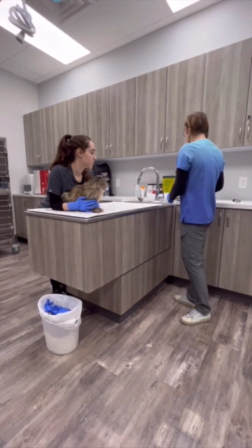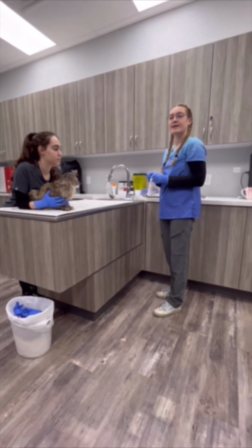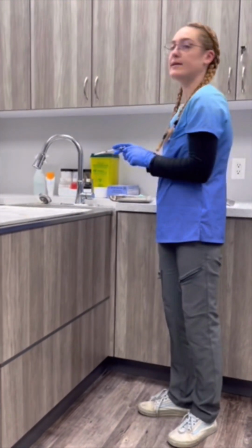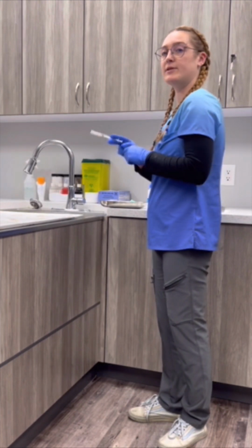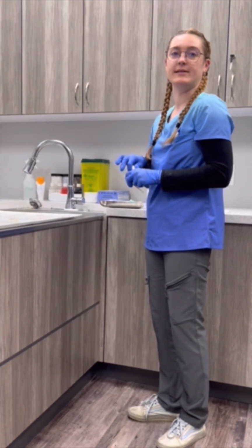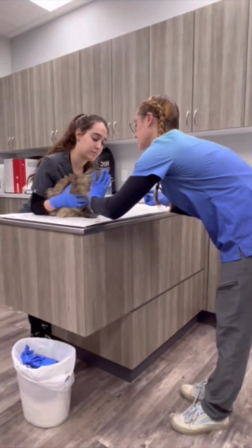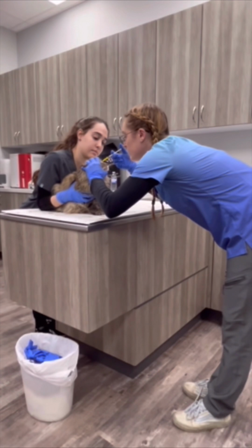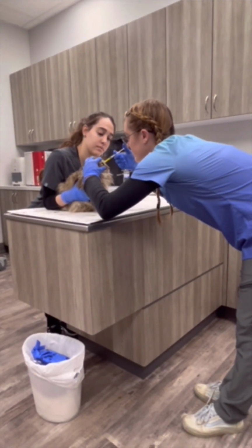Okay, I will now be performing a fluorescent dye stain test on Pup. I'm adding a dye strip to a sterile test tube and then adding saline solution to mix the dye. And then I'll be drawing the solution into a 1 ml syringe and removing the needle prior to administering the dye into the patient's eye. Just applying 1 drop into the right and to the left eye.